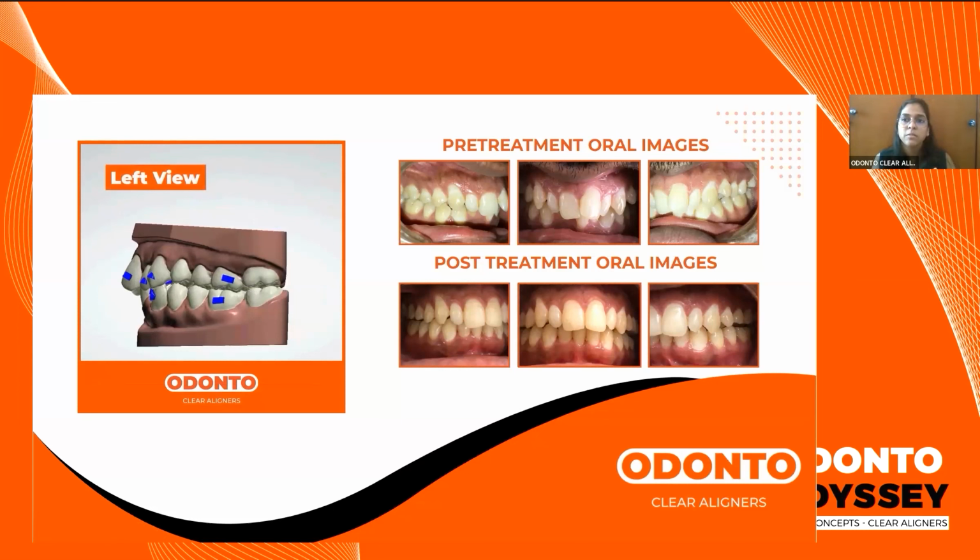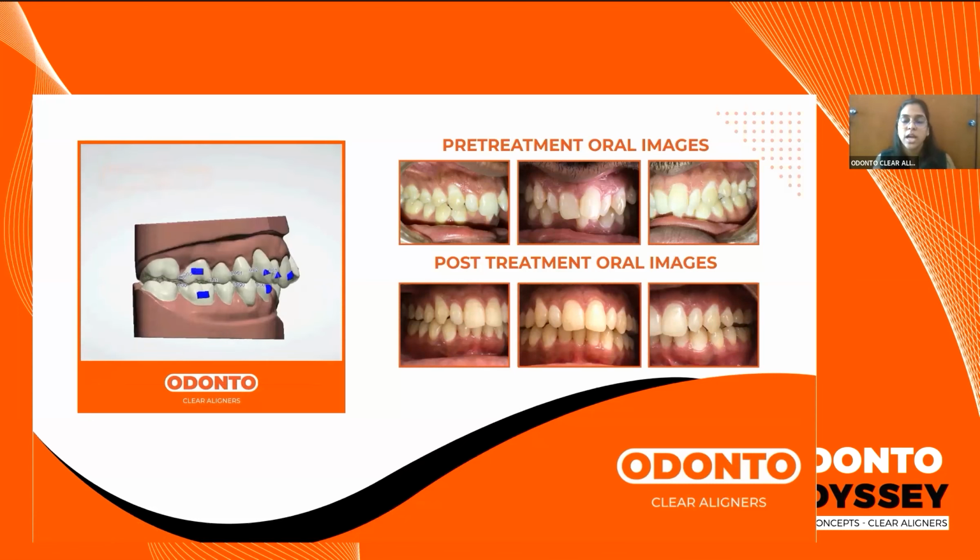Now, if we try to combine all these movements together, the problems which I mentioned previously in terms of loss of tracking of movement or the arch shape not following the plan can take place, which is why we have to sequentially expand posteriorly, hold the anterior teeth.